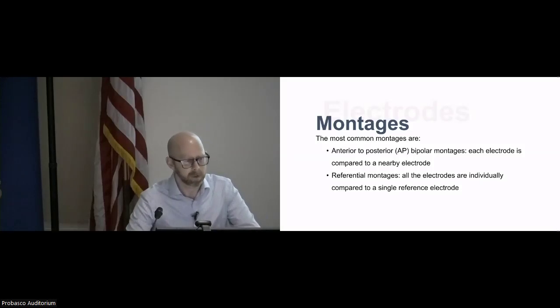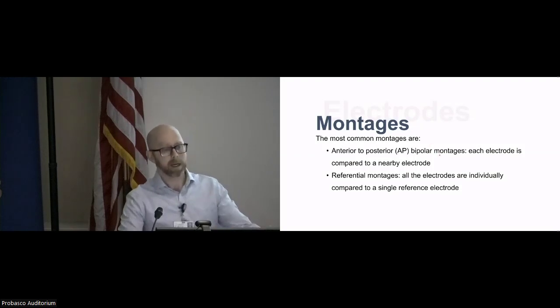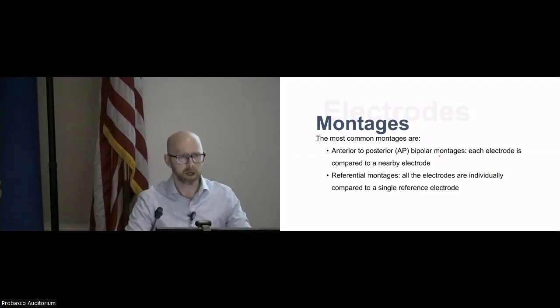There are times where we use more electrodes, but you don't really need to know that for hospital EEG. That's more like epilepsy pre-surgical evaluation, stuff like that. There are different ways to look at an EEG. You've probably heard this term, montages. Has anyone heard that term? I know I throw it in my reports. It can be really important to know what a montage is, and it has to do with how you compare electrodes one to another.